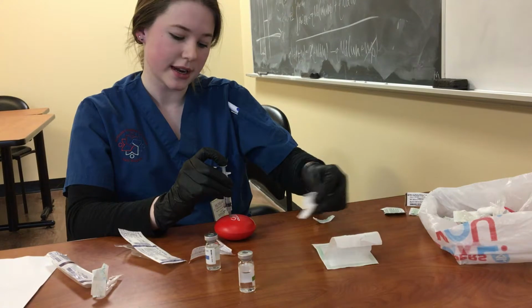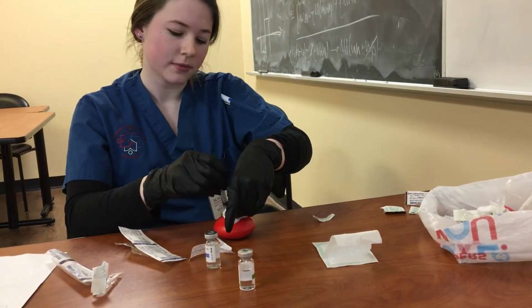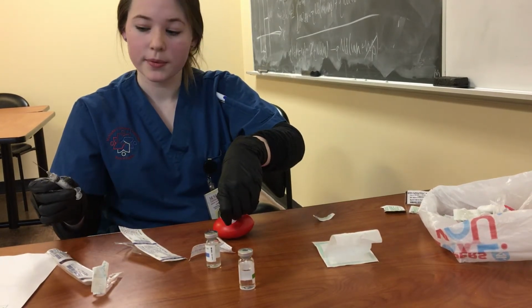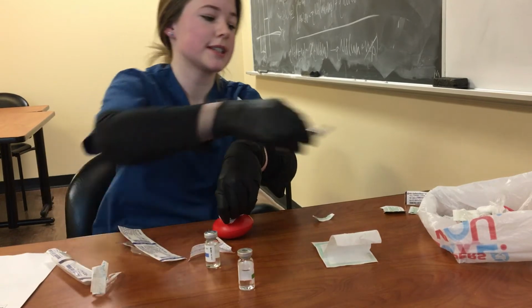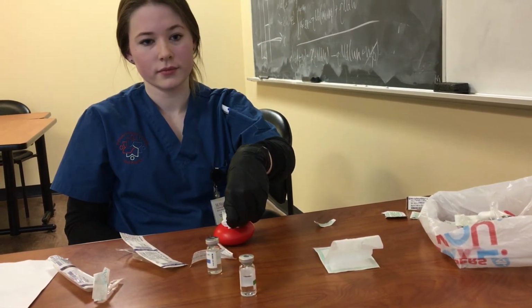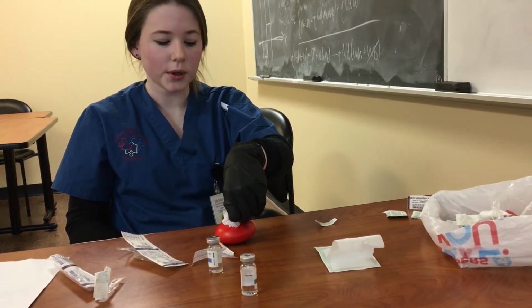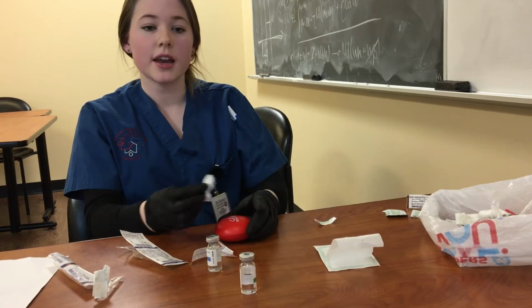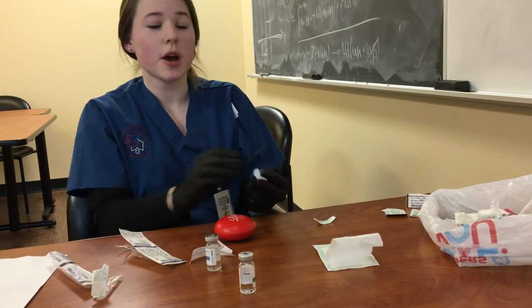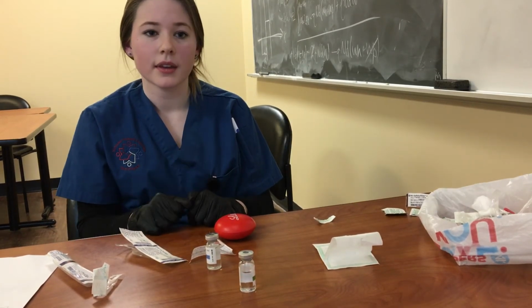Because I have my gauze right here, I'm going to bring it to the site of the needle, holding it tightly and withdrawing. Because this is a sharp, I'm going to be disposing of it in the sharps container. And I'm just going to hold that for a moment for the patient, again reassuring him to let me know if there's any discomfort, and I'm going to check in on him in probably about half an hour to ensure there's no swelling or erythema at the site.